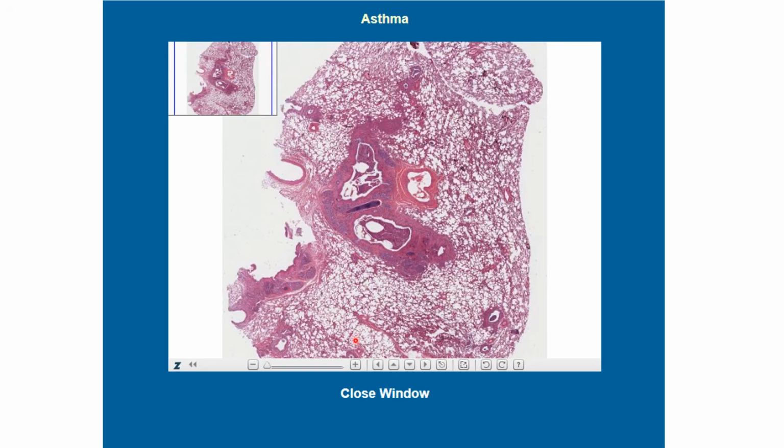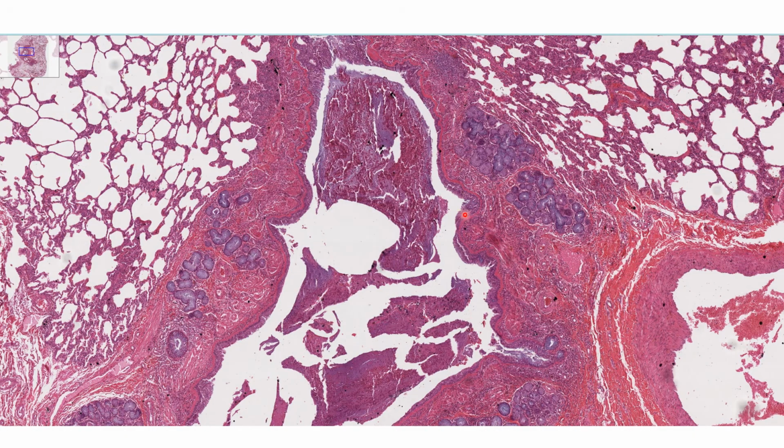Well, you are going to look into some of the virtual slides as well. First is bronchial asthma. When you look into this link later on, click on this button to open up the slides. When you open up the slide and zoom, please zoom slowly because this website can be quite slow.